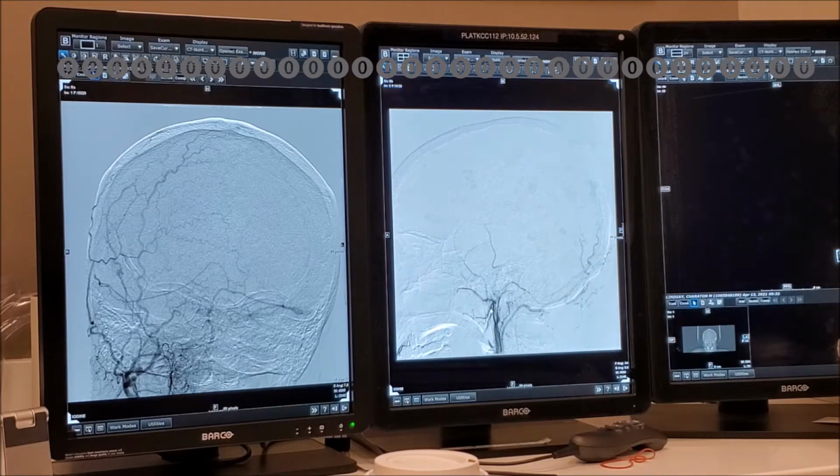This is the anterior segment branch, but you can see here coming down, it's ascending pharyngeal. So it's the pharyngeal component of the ascending pharyngeal. An interesting thing is when you see this loop here, this is the uvula. So in this particular individual, the pharyngeal supply is dominant from the ascending pharyngeal. This same thing can come more frequently from the ascending palatine, and we'll start looking at those things. But you can tell this is again the midline because of the uvula.